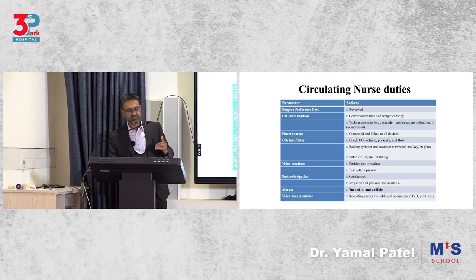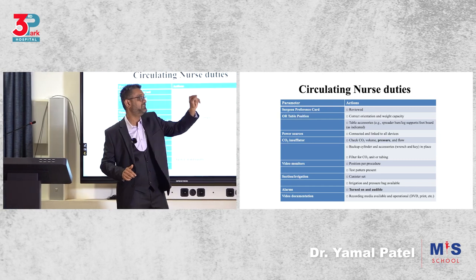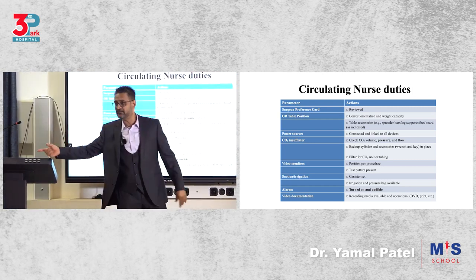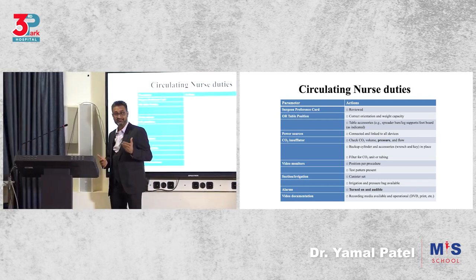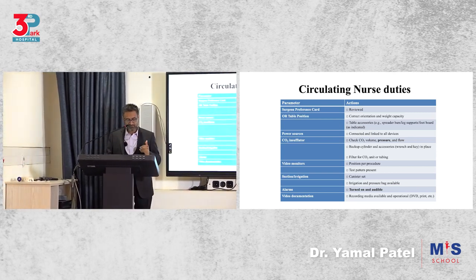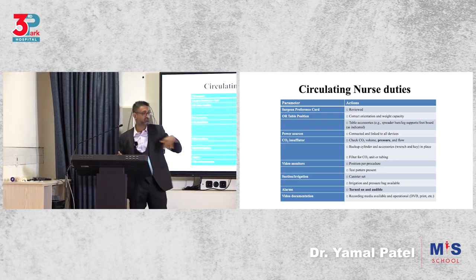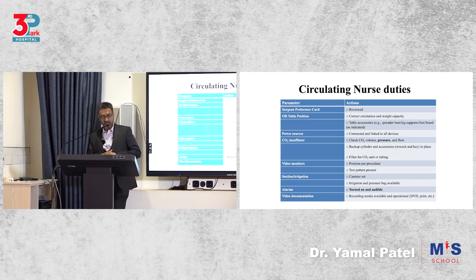Then you check, is everything connected to power? Yes. Is my CO2 okay? Yes. Are the settings correct? Yes. Is it connected? Is there a backup cylinder? Yes. So that's the checklist, so that you don't get unnecessary complications and delays. Is my video monitor in position? Is it too high? Is it too low? Is the distance appropriate? So put it there, okay?